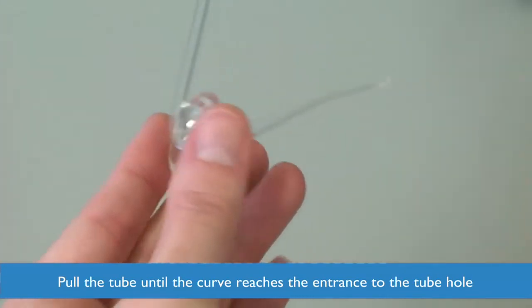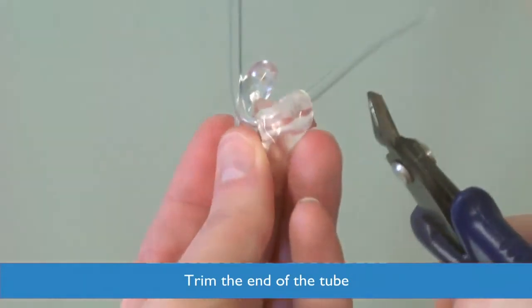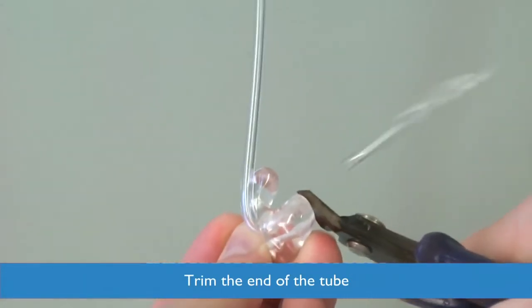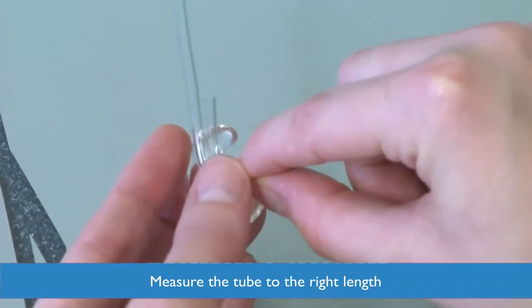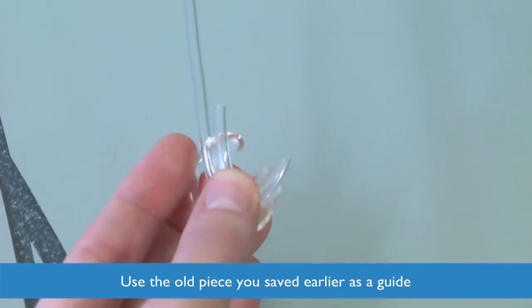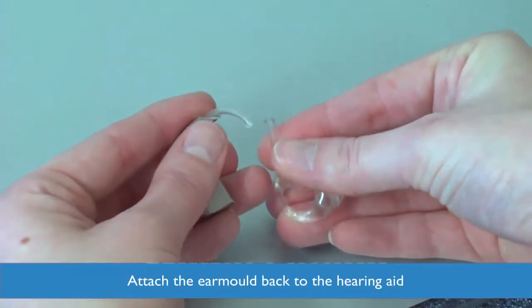Pull the tube until the curve reaches the entrance to the tube hole. Trim the end of the tube. Measure the tube to the right length by using the old piece you saved earlier. Attach the ear mold back to the hearing aid.